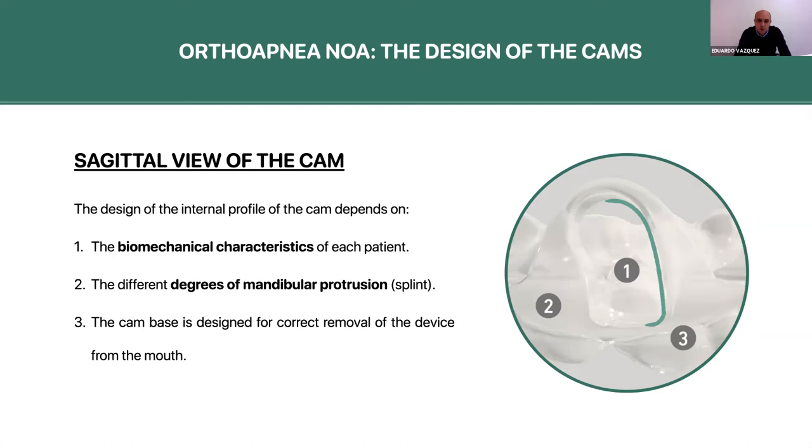By default, the height of the cam is going to allow 10 millimeters, as I said, of mouth opening. But if you want to change this degree of mouth opening, you just need to tell this to the lab, and the lab would change the size of the cam to allow less mouth opening, or even more if, for whatever reason, you decide that this is beneficial for the patient.